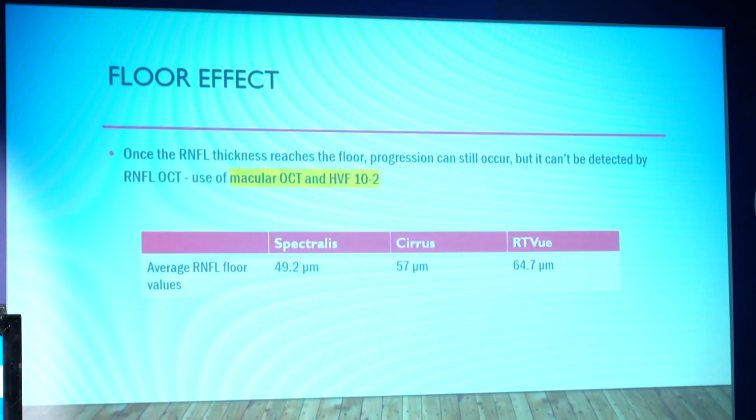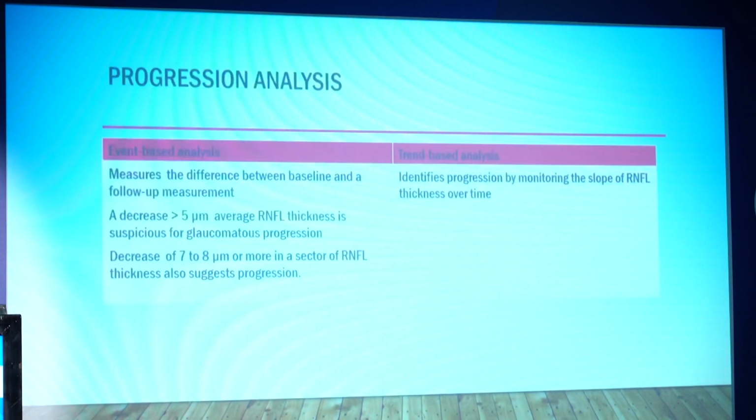So the floor effect is also shown over here in the various machines. Progression can still occur, but we cannot depend on this. We have to go for a macular OCT or HFA 10-2. So progression analysis can be event-based or trend-based.